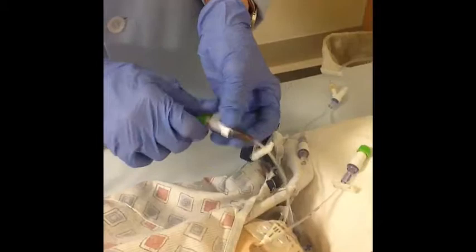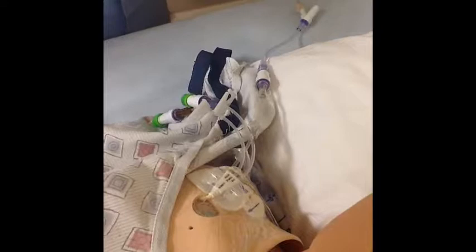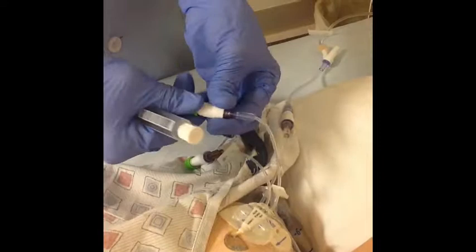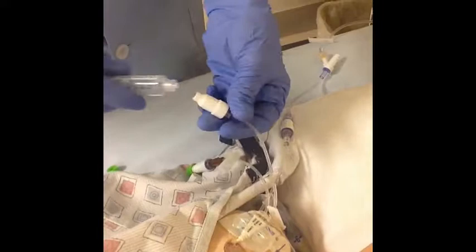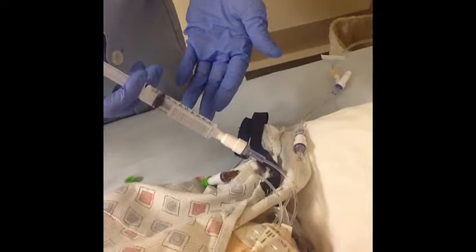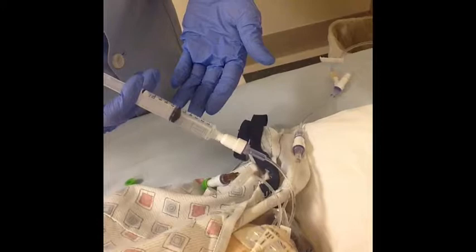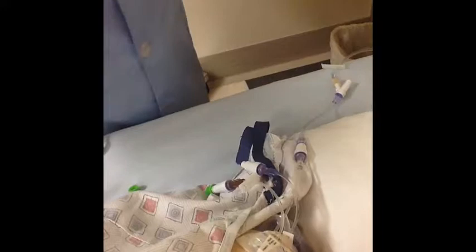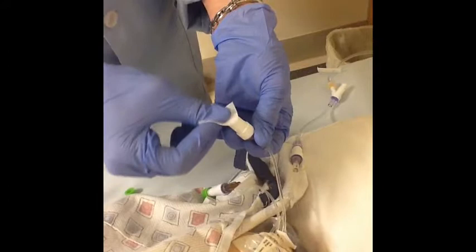Now I'm going to give my IV push. All my supplies are on the tray. We're going to start with our saline flush on this particular lumen — unclamp it, take off the curose cap, twist on the saline flush. This is a central line, so we have to flush with 5 to 10 cc's. I'm going to flush — everything seems to be working fine. We want to make sure the IV is okay and there's no pain. Now I have to scrub the hub for 15 seconds before giving my medication.